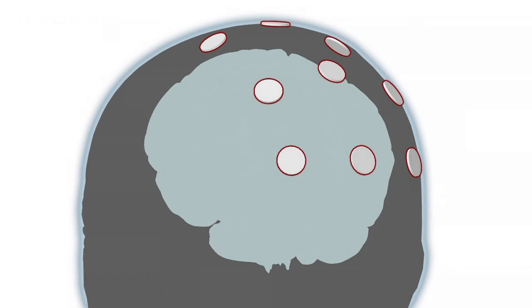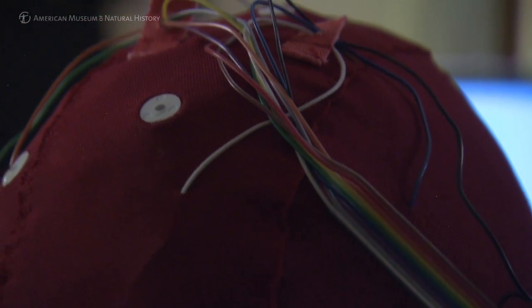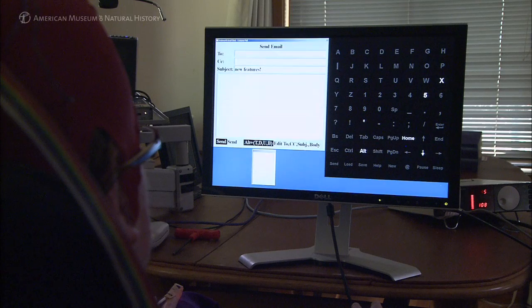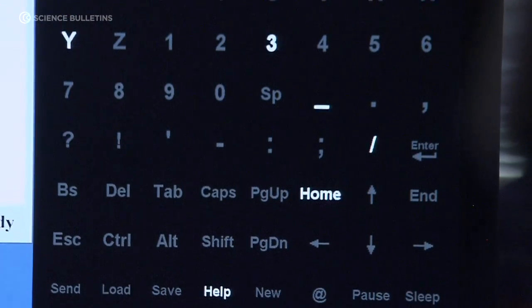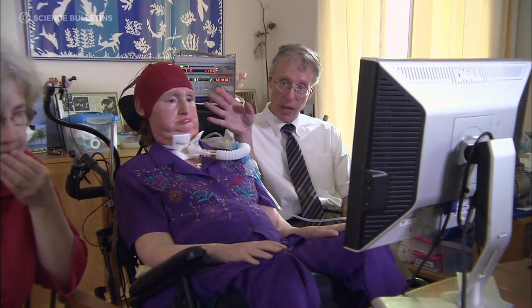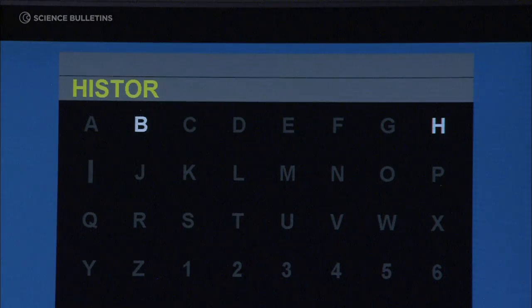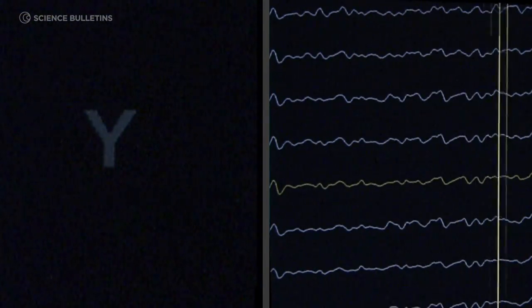The basic electrode cap has eight white discs, which are EEG electrodes that touch the scalp. The system shows the person a matrix of letters, numbers, and function calls, and groups of them are flashing very rapidly. The system looks at her brain waves and the response in those brain waves to the flashes. When the group that contains the letter she wants flashes, her brain says 'aha,' the brain waves are different, and we can pick that up.